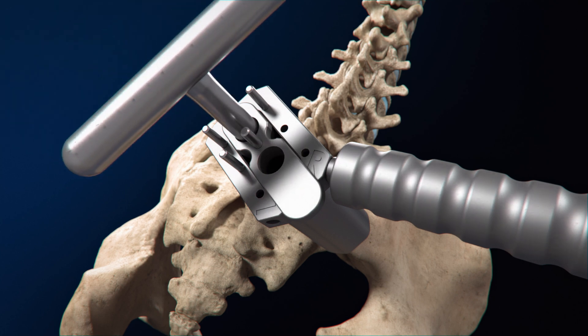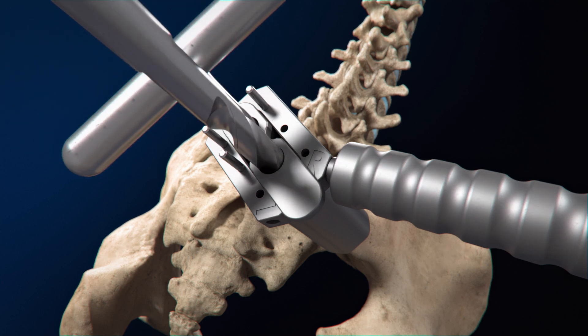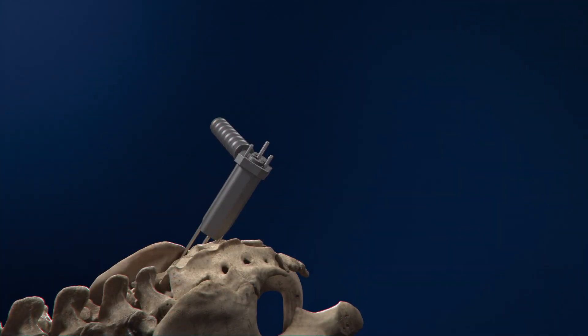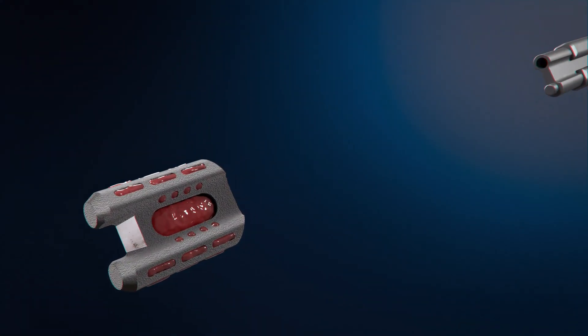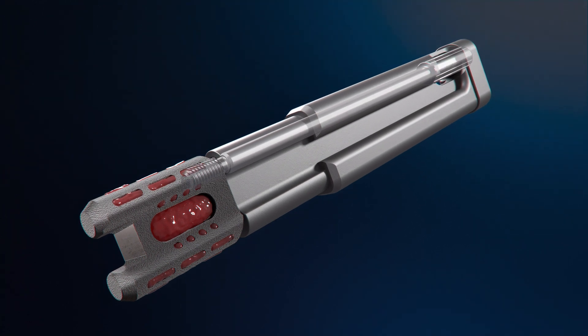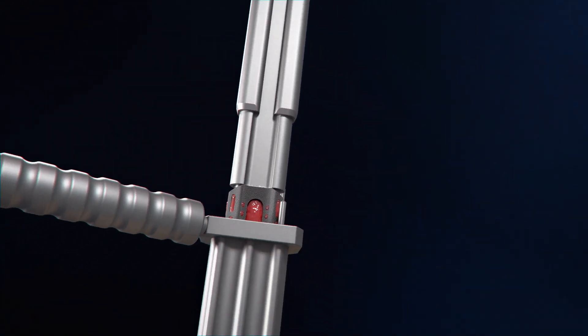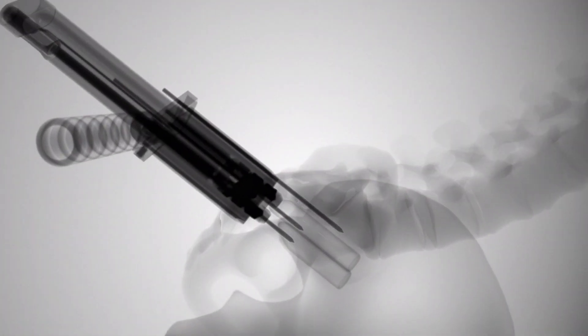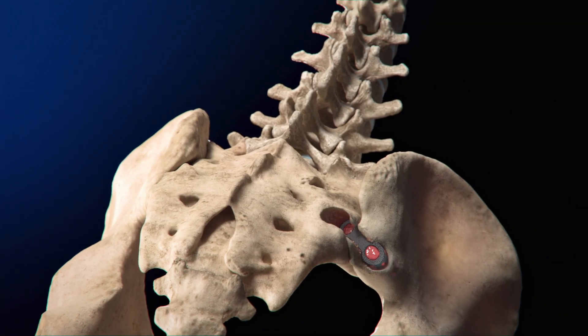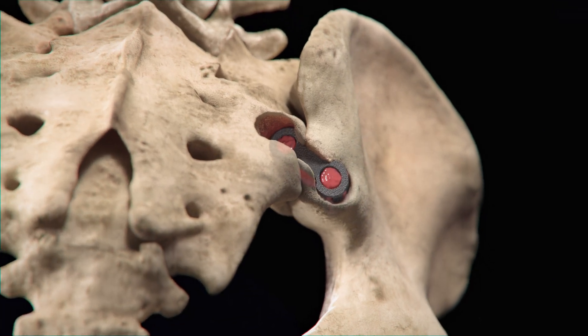A temporary pin maintains position as the second pontoon channel is drilled. The drill guide and graduated guide wire are removed. The Catamaran's open framework and fenestrations are designed to be filled with bone graft to promote bony ingrowth. The inserter screw is threaded into the Catamaran implant and delivered into the access sleeve as the implant is tapped into position. The osteotome bridge is designed to decorticate the joint, transfixing the SI joint.